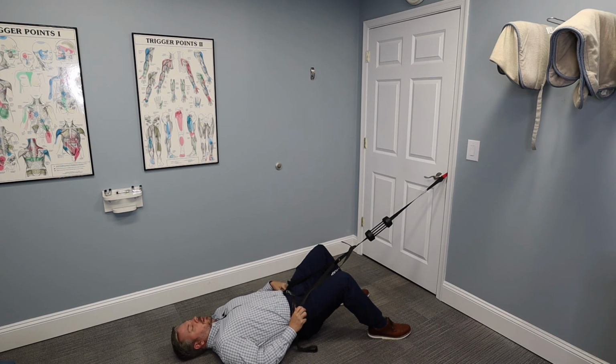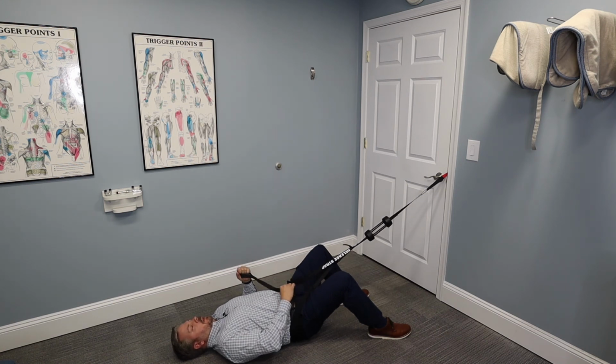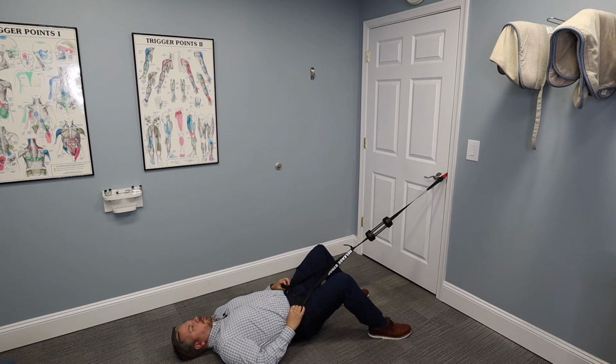Now if we wanted to decrease the pressure, this little loop right here, if you pull on it, gives it a little bit of relaxation. With a spinal decompression table, typically it stretches for 45 seconds and then relaxes for 30. The problem with inversion tables is unless you flip back up, you're not going to get that relaxation. What I like about this unit is there's a simple handle here, and you just pull on it, and you can hold that, it takes the pressure off. It's that relaxation period for the spinal decompression table. And then you can relax again.